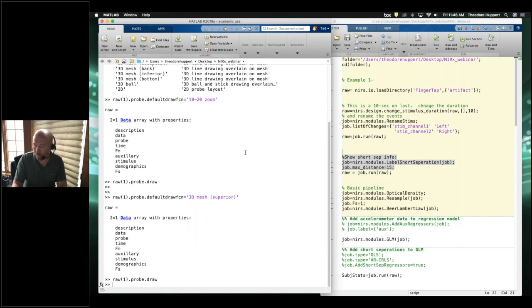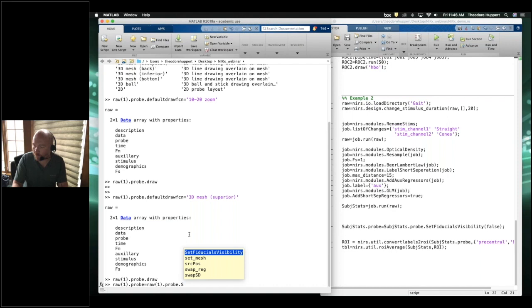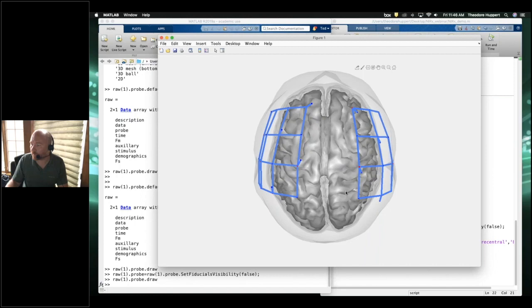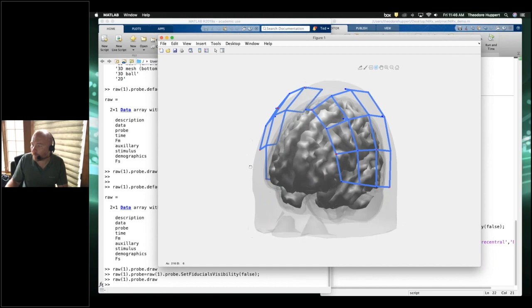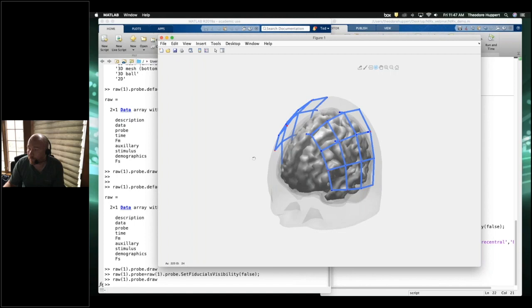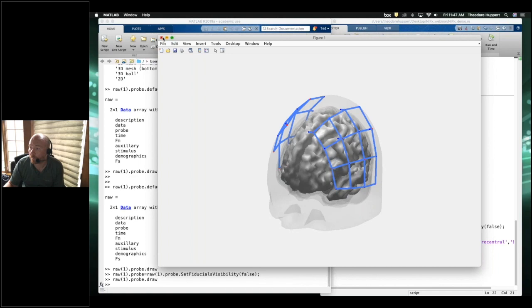If you don't like the fiducial marks, you can call probe.set_fiducial_visibility and set it to false — now when you draw it those 10-20 labels turn off so you can see the brain better underneath. You can see the probe has short distances in it — a number of long three-centimeter distances plus a short approximately seven-millimeter separation.